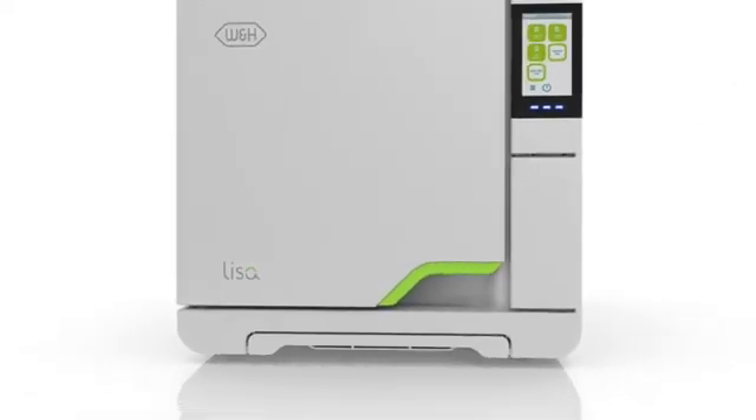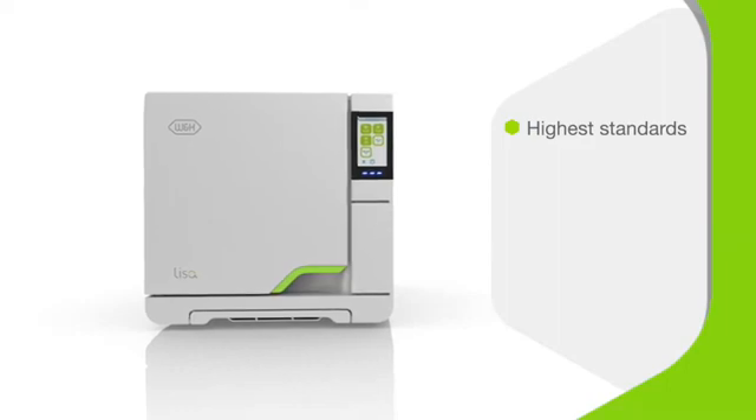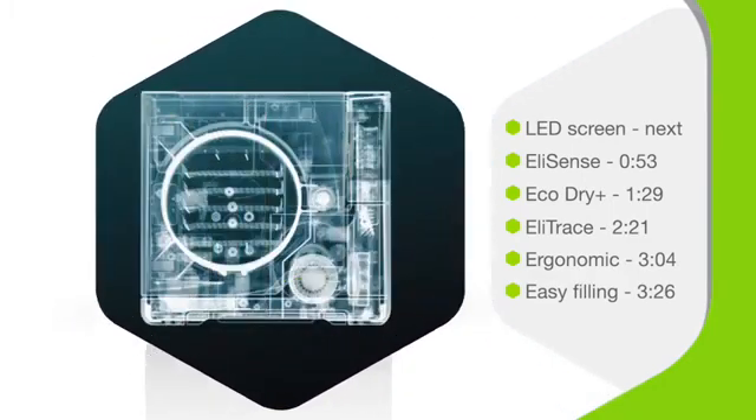Introducing the Lisa VA-131 Vacuum Sterilizer. This type B sterilizer from W&H processes to the highest standards of safety and hygiene in modern dental practice — reliably, efficiently, and faster than ever. Keep watching to discover how the Lisa is incredible inside and out.